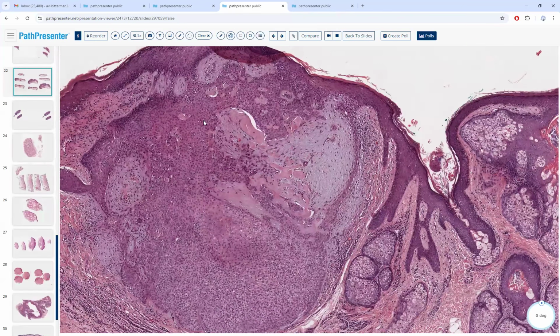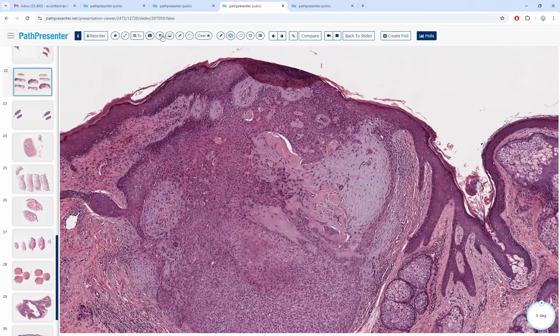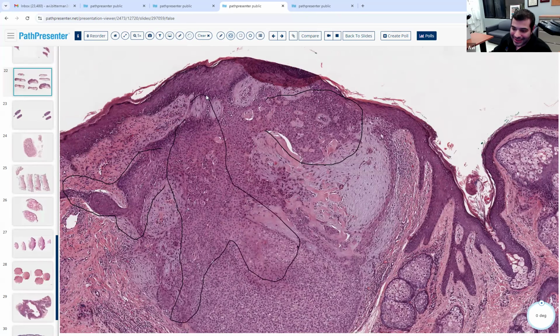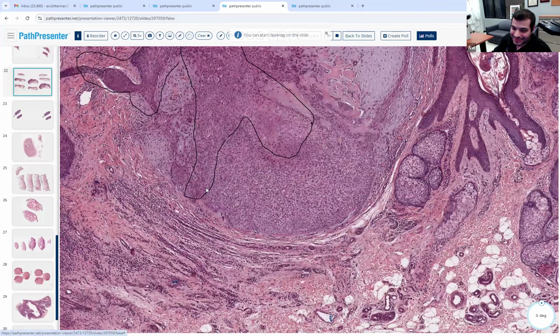Was it the actual portion of the tumor is not symmetric? Well, it's not perfectly symmetrical, but look, here it's got some areas coming out here. Here's an area coming out here, just like it did on the other side. It's got a center. And it has this area, which has a similar type of differentiation we saw earlier.